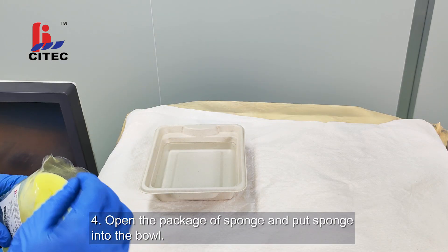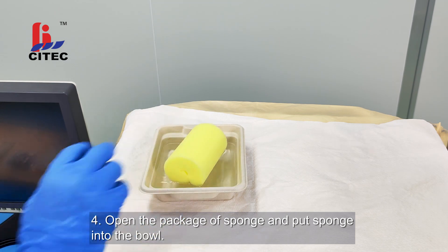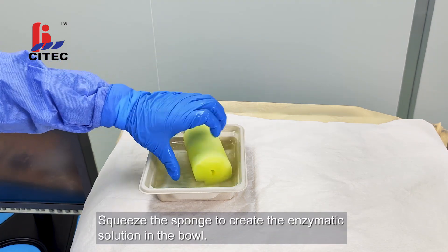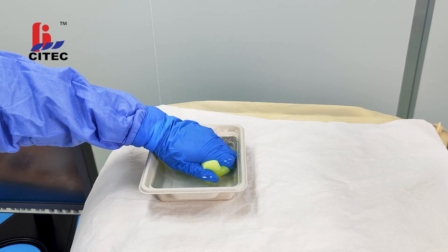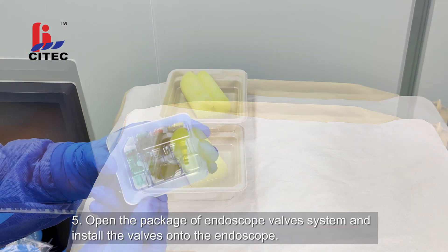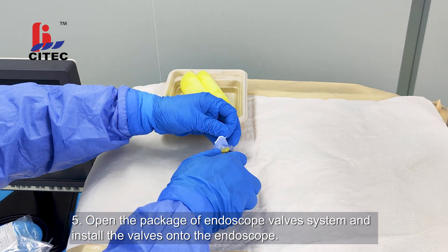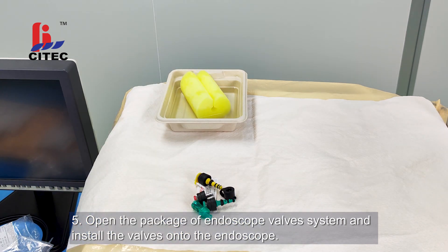Step 4: Open the package of sponge and put sponge into the bowl. Squeeze the sponge to create the enzymatic solution in the bowl. Step 5: Open the package of endoscope valve system and install the valves onto the endoscope.